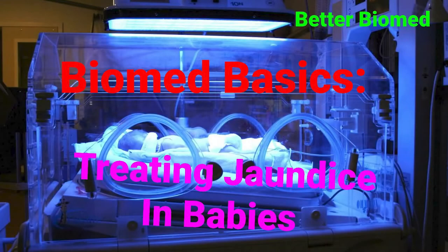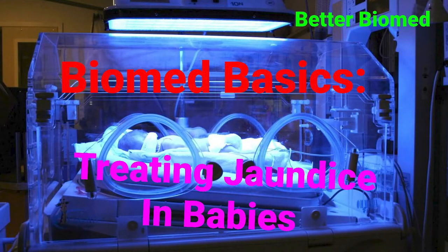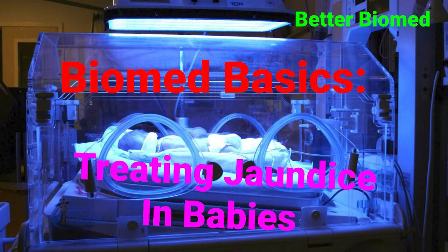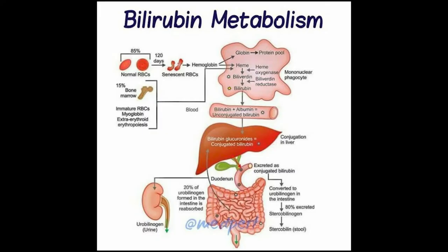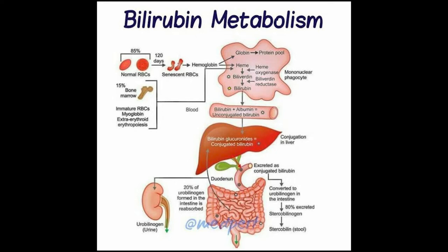Hello everyone, and welcome back to another Biomed Basics video. Today we're going to talk about bilirubin and bili-lights and how they're used to treat babies. Jaundice is a symptom of a failure in the bilirubin metabolism cycle.